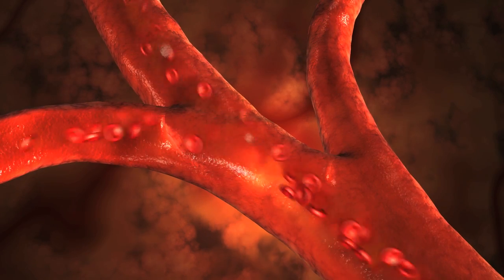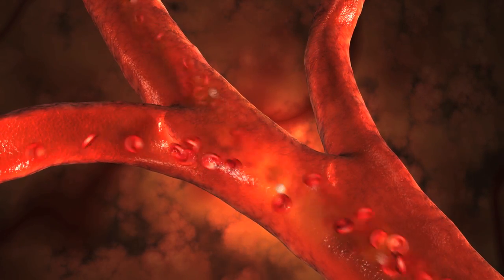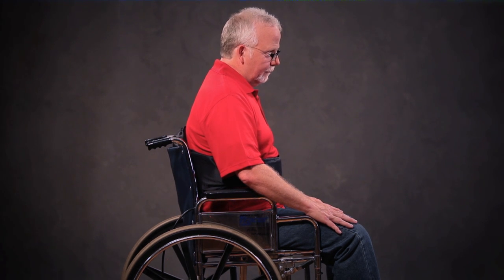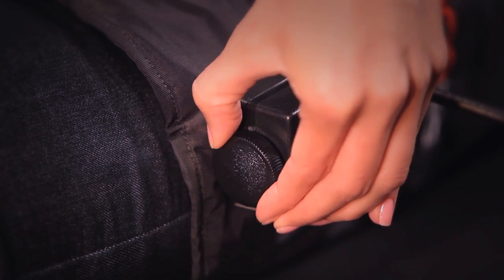The field can also change naturally from the relaxation of muscles and the increase of blood flow resulting from the treatment. In either situation, if the garment goes out of tune, either move the patient back to the original position or simply adjust the tuning knob to get them back into tune.